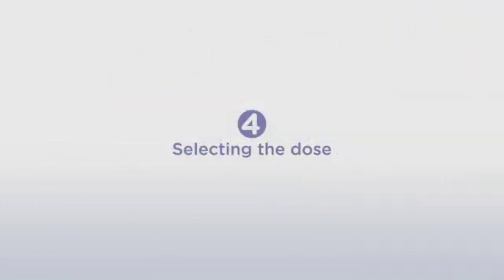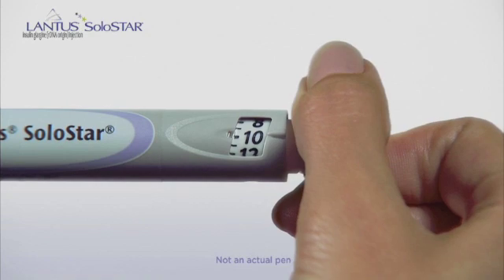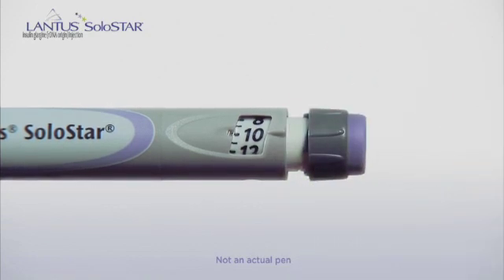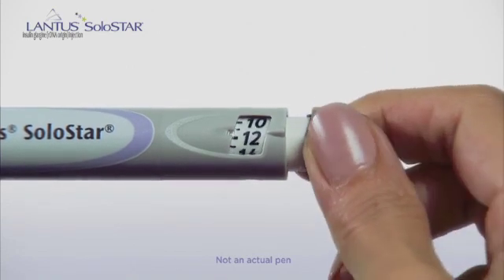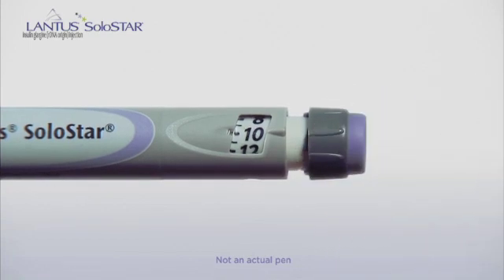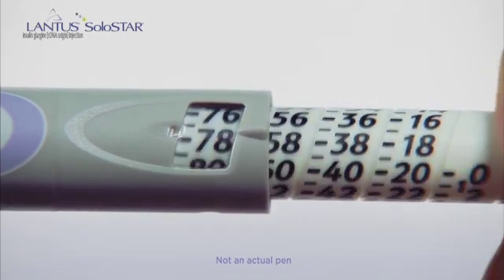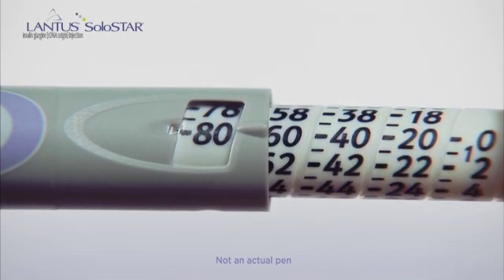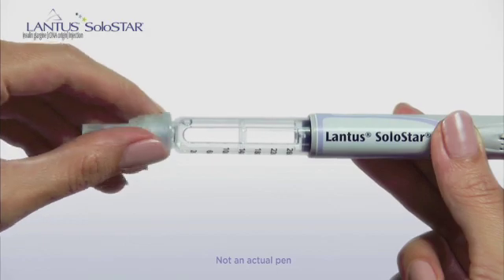We're already halfway through, so let's go on to Step 4, Selecting the Dose. Dial the dose your doctor has prescribed for you. For this demonstration, we're dialing a dose of 10 units. A great feature of the Lantus Solostar pen is that if you dial too little or too much, you can dial back up or down until you reach your dose. But the dose can't be dialed past the number of insulin units that are still in the pen. The pen has an automatic safety stop at 80 units. If you need a dose of more than 80 units, then you must give yourself another injection.